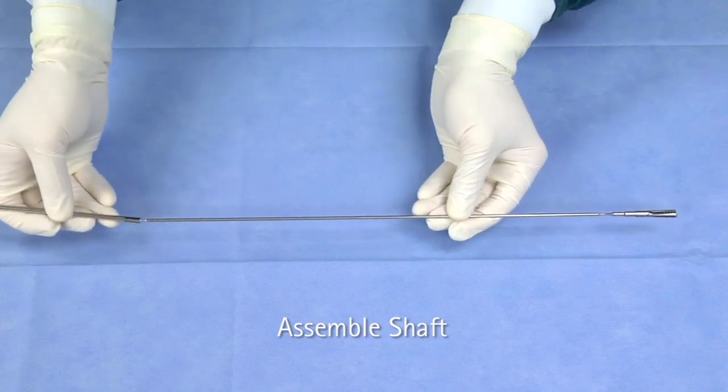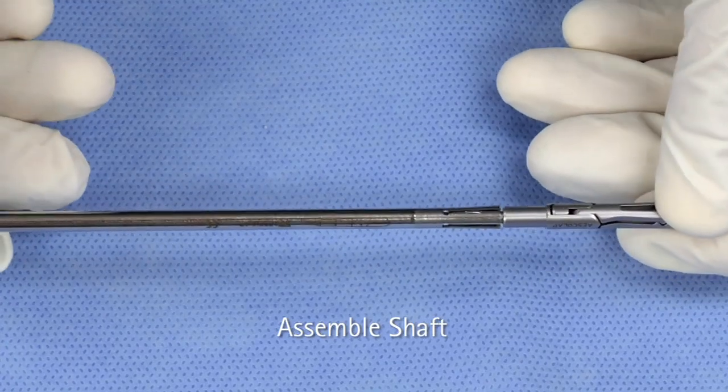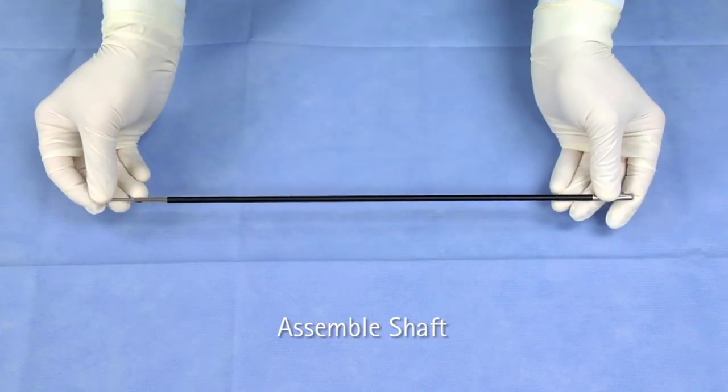To assemble the Sovereign laparoscopic instrument, slide the inner metal tube onto the jaw insert with its four spring tongues towards the working end until the tongues snap into place. Next, slide the outer insulation tube as far as it will go over the inner metal tube.